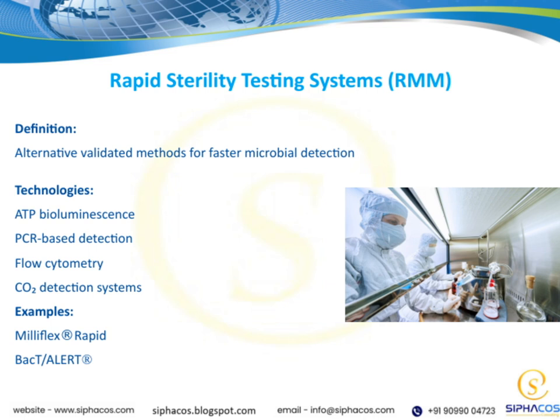Some of the key technologies used in these systems include ATP bioluminescence, which detects microbial activity by measuring light emitted from ATP, the energy molecule in all living cells. Then, we have PCR-based detection, which amplifies microbial DNA to identify contaminants quickly and accurately. Flow cytometry is another advanced technology, allowing us to analyze individual cells rapidly, giving immediate insights into microbial presence. Lastly, CO2 detection systems monitor the production of carbon dioxide as an indicator of microbial growth.